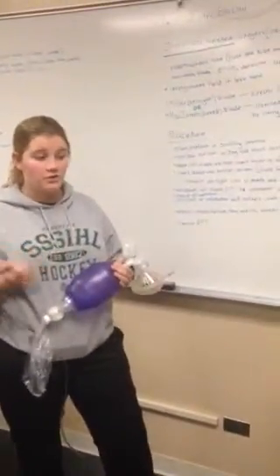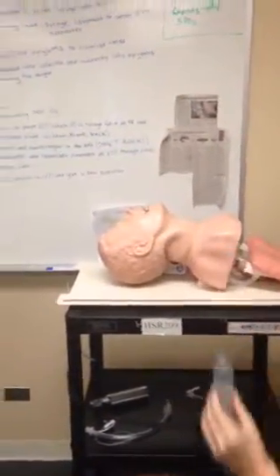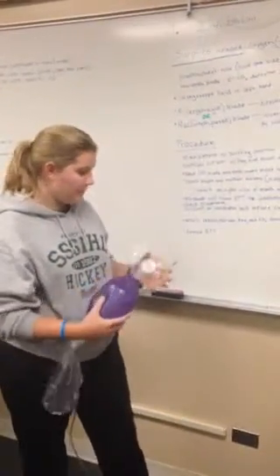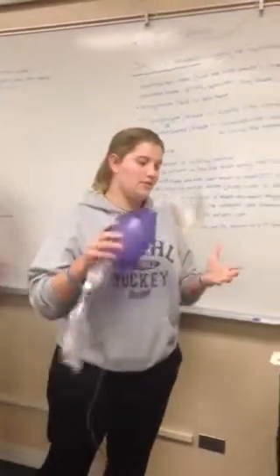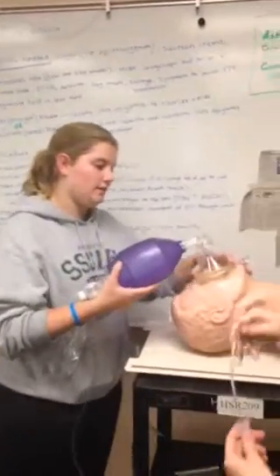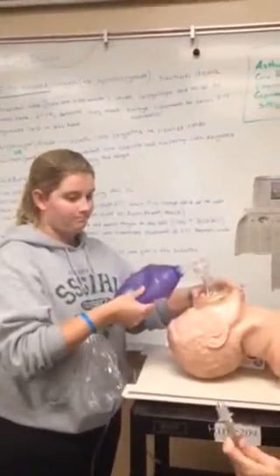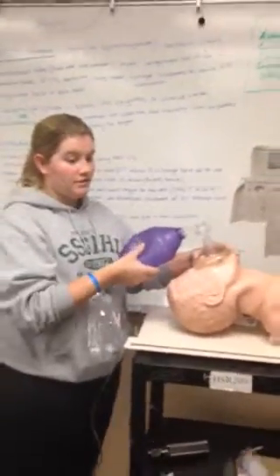You'll also need a syringe to inject air in order to make sure the ET tube is secure in the trachea. We will now begin the procedure — there will always be an intubator and an assistant. As the intubator, I am going to bag the patient with the C and E technique and put them in the sniffing position, making it easier to place the ET tube. While I'm doing this, my assistant is getting the supplies ready.